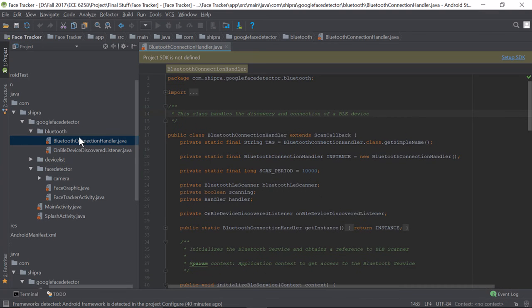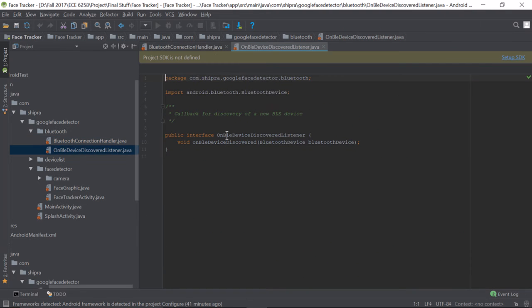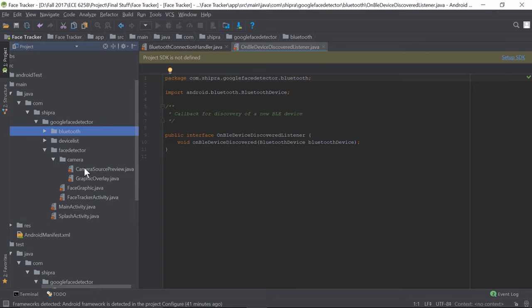Now, under the Bluetooth folder, you'll basically find all the features and the functions that are being used to call the Bluetooth, scanning the devices, and sending the data to the hardware, etc. So all those things can be found over these two folders. And then device list, as I said, will check for all the device lists that are available. Face detector is basically where all the source code is running.